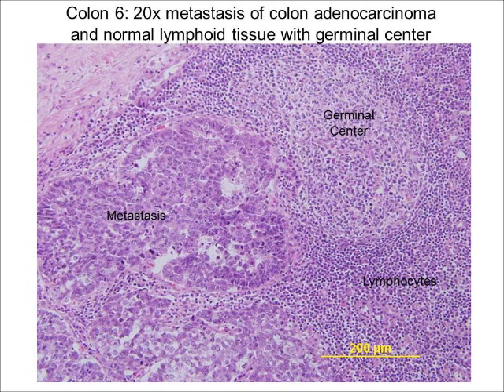Switch to higher power and observe the metastasis. It is a continuous mass and still retains some of its epithelial character. It is also rather homogeneous. The cells are large, with large nuclei, easily distinguished from the surrounding normal lymphocytes, which resemble small dots.